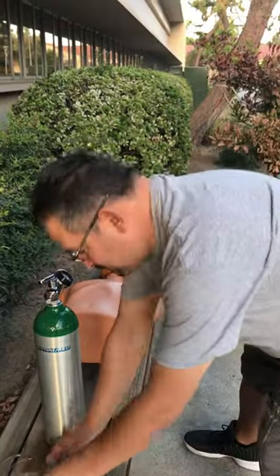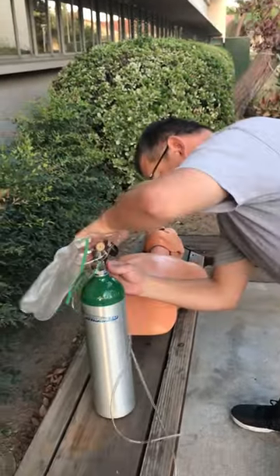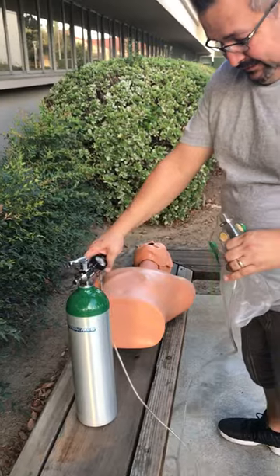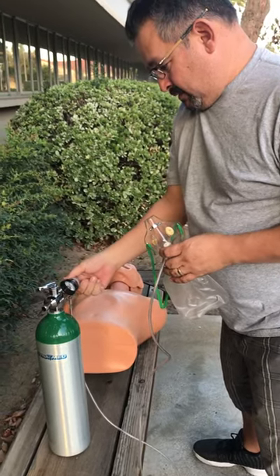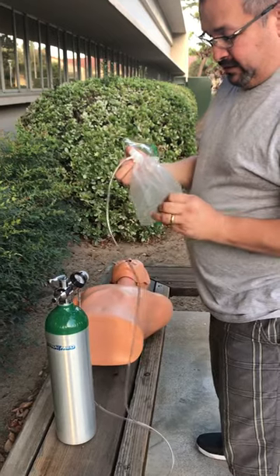Attaches non-rebreather mask to correct port of regulator — attaching the non-rebreather bag. Turns on oxygen flow to pre-fill reservoir bag. Bag is filled.